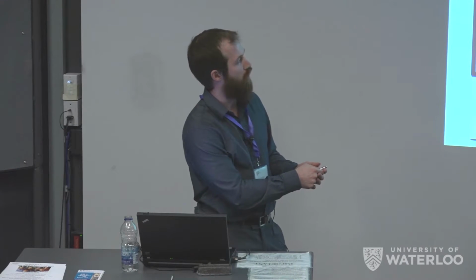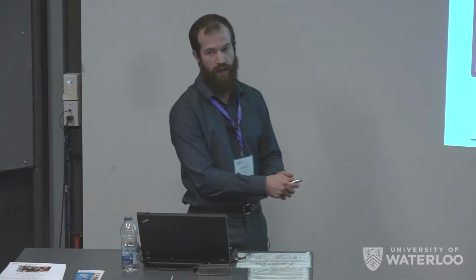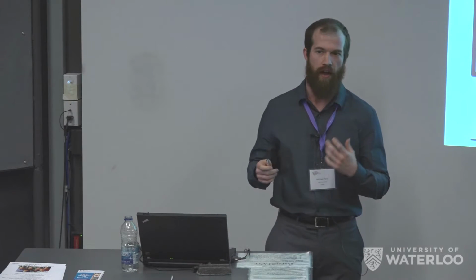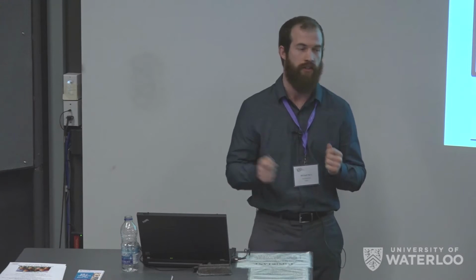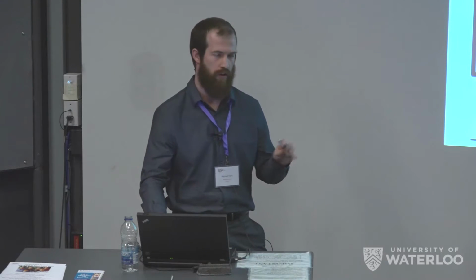And so when we look at the lean tissue mass, I'll skip the ultrasound measures because they're not really that intuitive, but I'll hop onto the lean tissue mass from our DEXAs. So we have a pretty average lean tissue mass, as well as one important aspect of our DEXA scan: there are cut points that can identify people below that disability threshold. So if you take the lean tissue in the arms and the legs and you normalize it to their height, you can identify people who are below that threshold. And so with our population, we have so far identified 1 male and 5 females who are below that threshold. So that'll come up a little later.